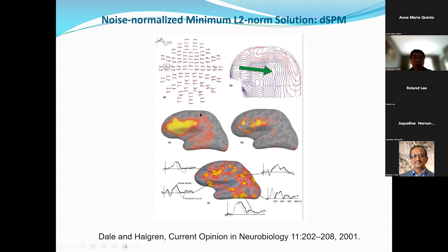In that paper, they also compare the same test using functional MRI, with the BOLD contrast. The fMRI result is more sparse, more focal. And then they use the fMRI as a constraint on the MEG result. Figure E is the fMRI-constrained L2 minimum norm solution. They have some signal somewhere in between. But the straightforward L2 minimum norm solution has the advantage of being easy to compute, but the disadvantage of relatively poor spatial resolution.